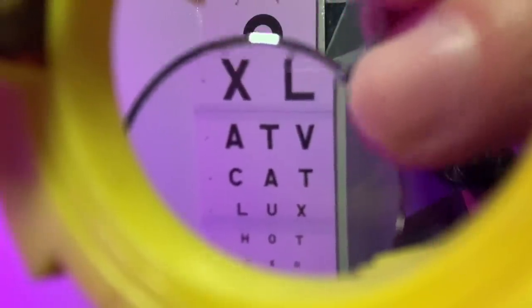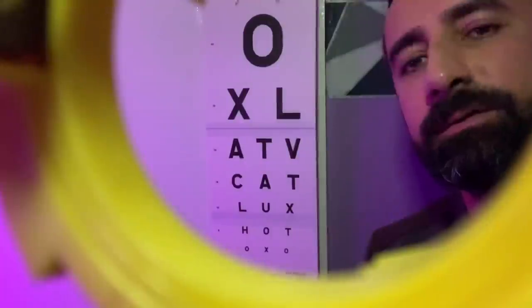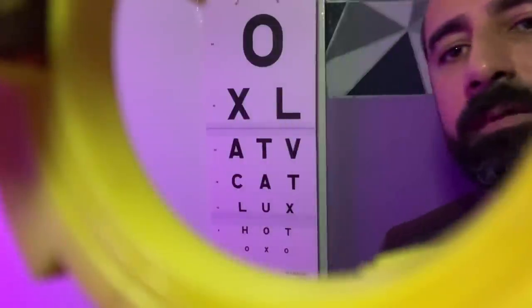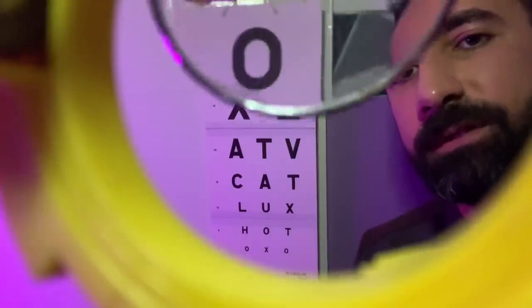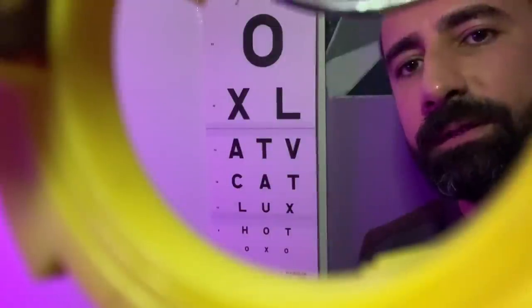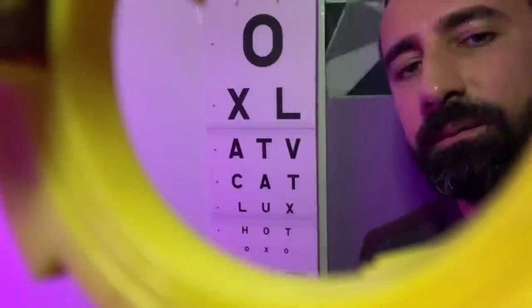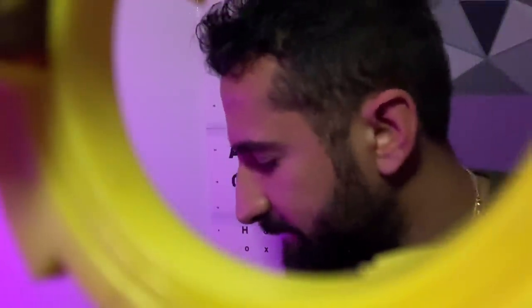So, that's with. Or clear without. Sharper with. Without. Without. Okay, let's try the next lens. And the smallest row you can see, sharper with the lens, or without, with, without, excellent, okay, we'll leave that one out.